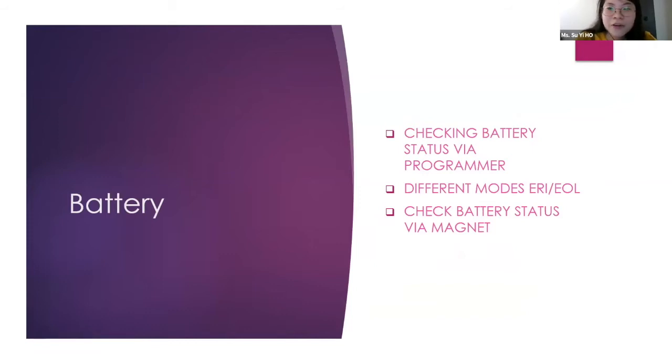Okay, next, the favorite question asked by my patients will be, how much longer can my pacemaker last? It's also important, for the most simple reason, that we don't want the pacemaker to run out of battery and have the patient fainting on the street, and also to give us ample time to schedule for a device changeout.